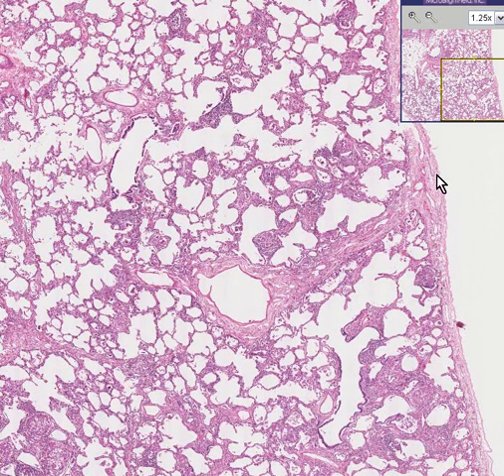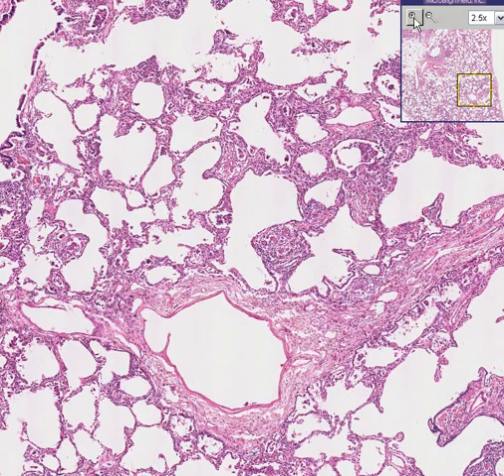And if we looked very closely at this, we'd probably see some mesothelial cells lining this visceral pleura too, wouldn't we? I think we can see blood vessels and bronchi and the fact that most of this lung is aerating. If you were to feel this lung with your finger, even with your eyes closed, you would say it feels nice and airy and spongy.